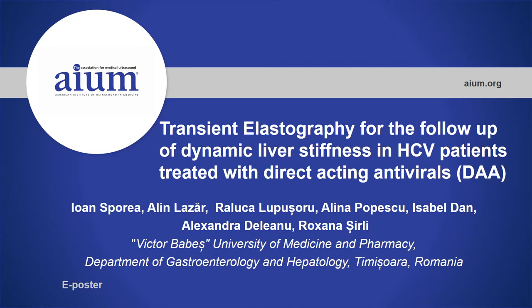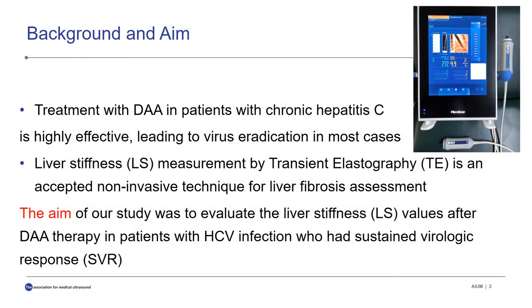Hello. It's my pleasure to make this presentation about the value of transient elastography, so-called FibroScan, that is used for follow-up over time in patients with chronic HCV infection that was treated with direct-acting antiviral drugs. This presentation comes from the Department of Gastroenterology of the University of Medicine Timișoara in Romania.